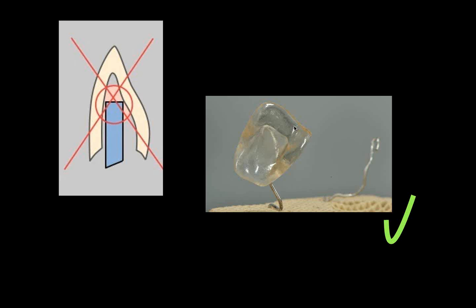We don't get any distortion. What we don't want to do is put ceramic pins in here, because during the heating process, the ceramic here will expand, the pin will maybe slip in, and then your crown could crack. That's why we want platinum pins.